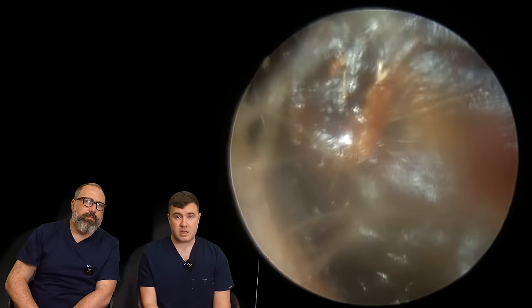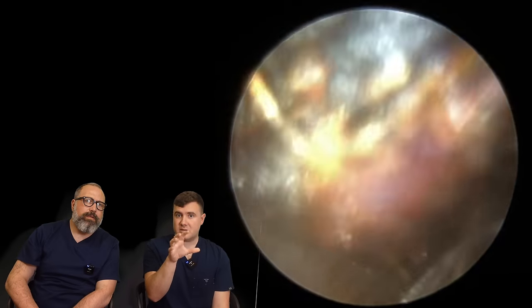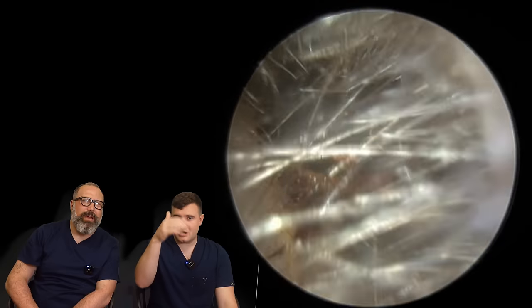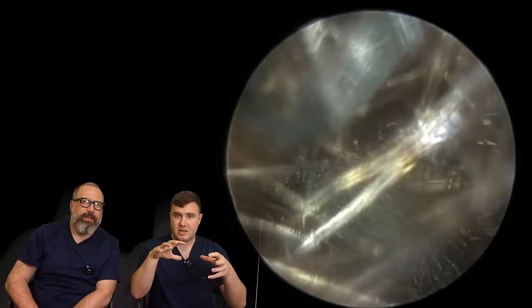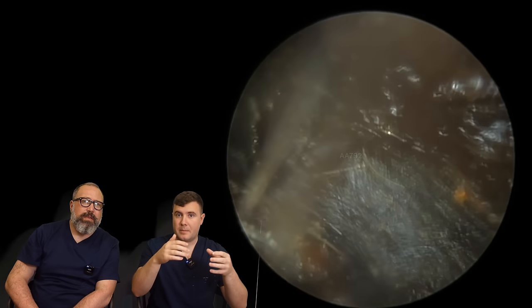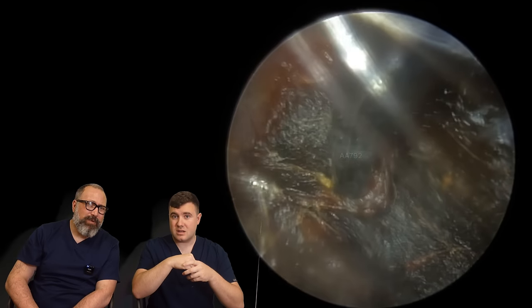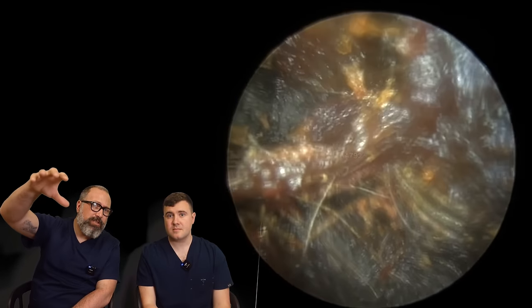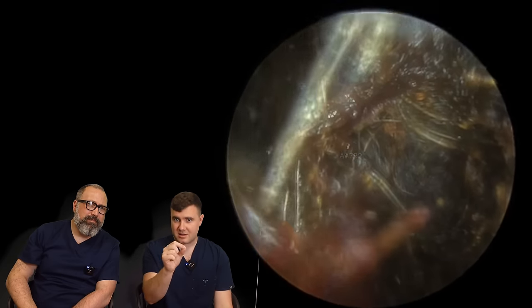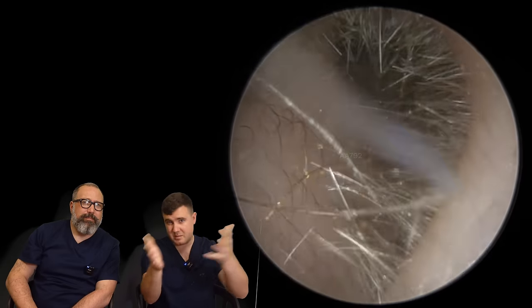We've swapped tools. We've popped into the ear now with the Jobson hone. There was a little gap above the wax, so I've tried to get as far back as I safely could. What I'm hoping is happening is we've just kind of sheared a little trench in the middle of this wax. Now, what I'm hoping is going to happen — as we start to loosen this off the top of the ear canal and get a good grip with the Jobson hone — is that this whole plug is just going to start sliding forwards. That is thick as anything. We can't go crazy with this, we can't go too far. I'm just sticking with what we can see, trying to loosen the wax from the ear canal.